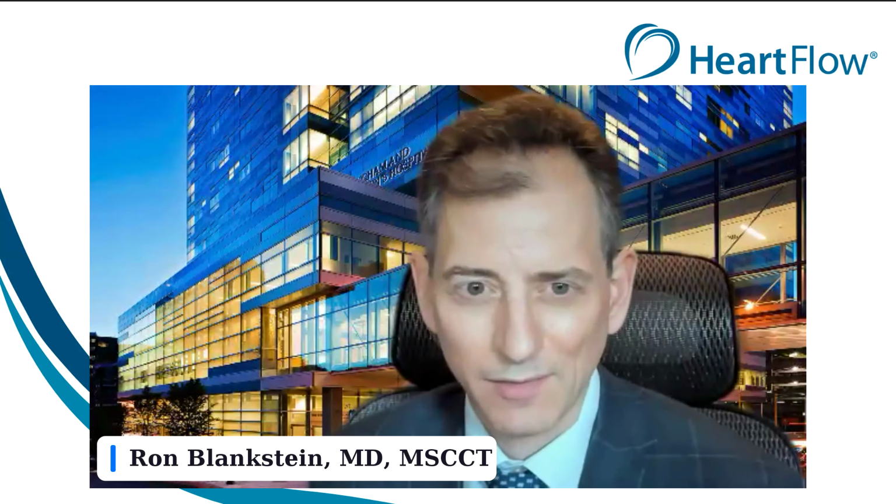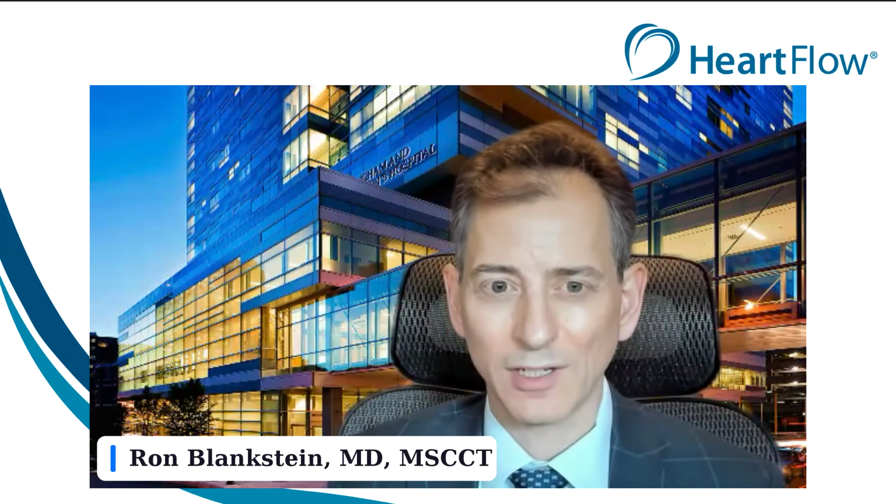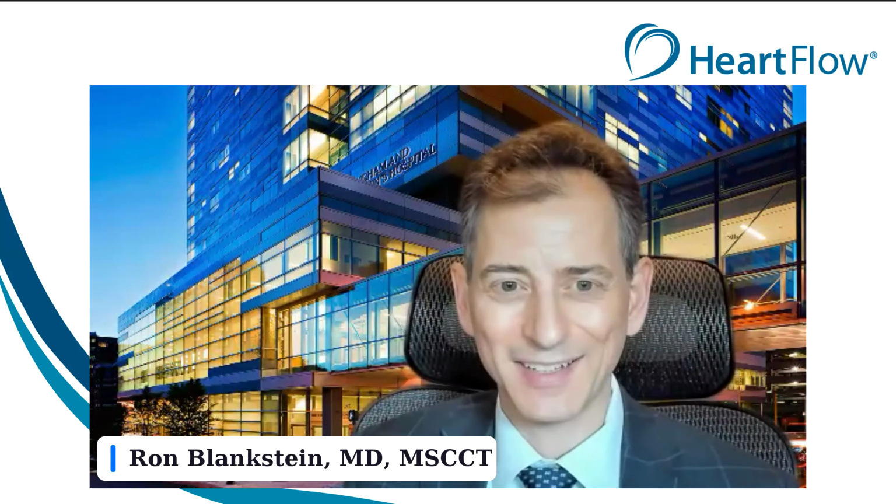I'll start by saying I think it's a very challenging concept. I think in cardiology, this term vulnerable plaque, that was coined actually in my institution over 20 years ago, has kind of been a holy grail both of non-invasive and invasive imaging. But the problem is that you need a very good positive predictive value, a good specificity to be confident enough to say, yes, that is really high enough risk that you're going to do something locally, a local therapy, a stent. In reality, I've yet to see data that tells me that.